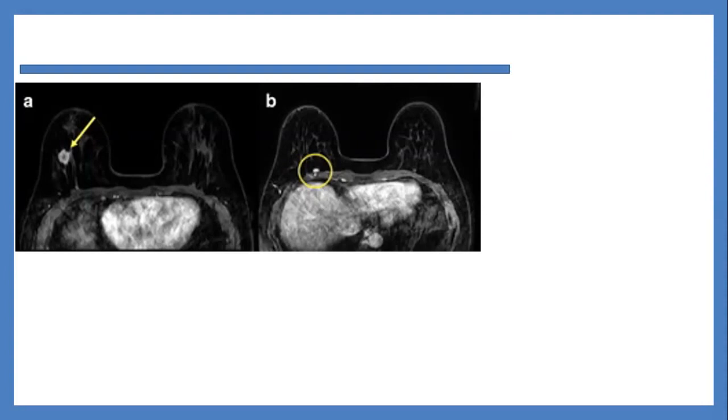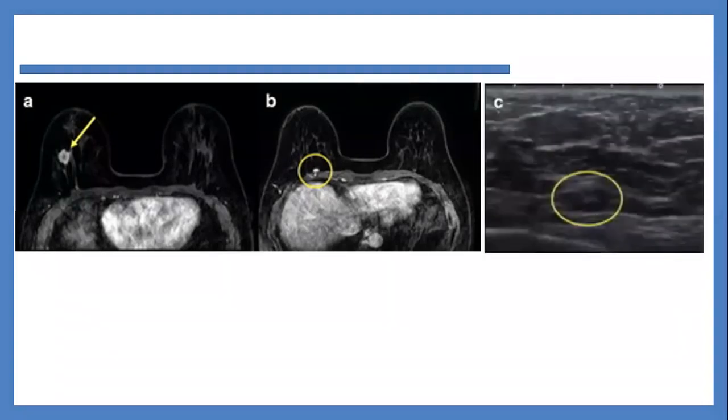Ultrasound is complementary. After MRI we are doing targeted ultrasound. We call it second look ultrasound.